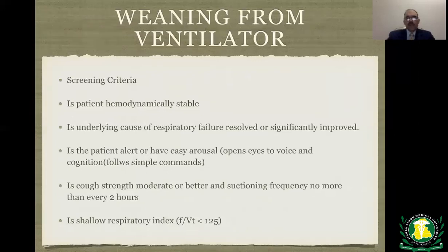Now, weaning from the ventilator. The weaning from the ventilator is basically common sense. First of all, the problem for which the patient was intubated has resolved or significantly improved. Second is off of sedation. Is the patient fully awake, alert, follows commands, making eye contact?